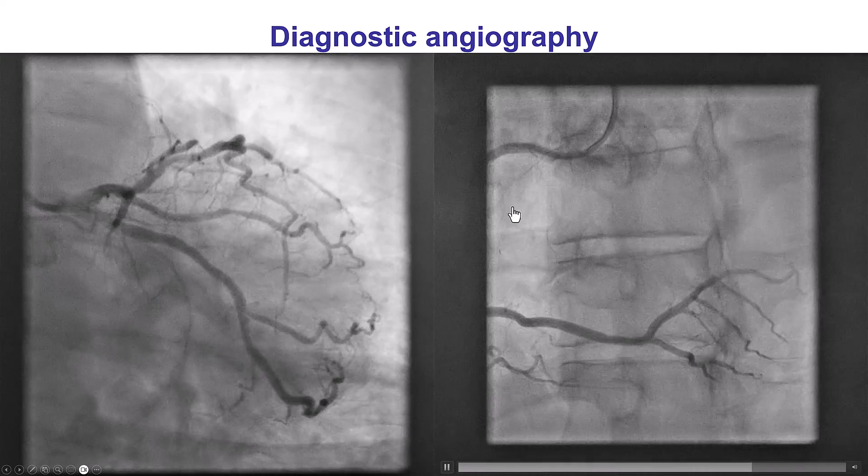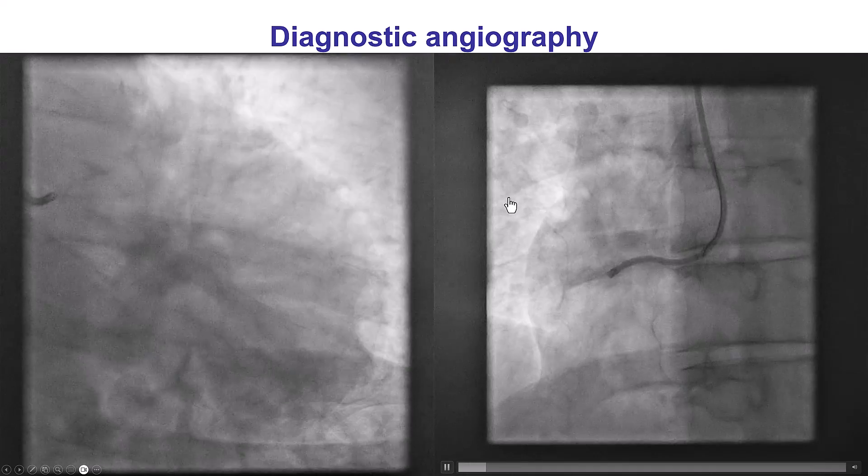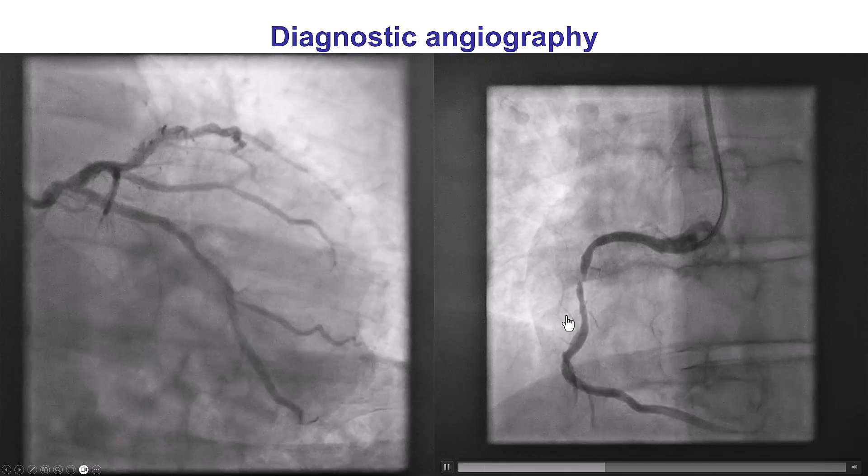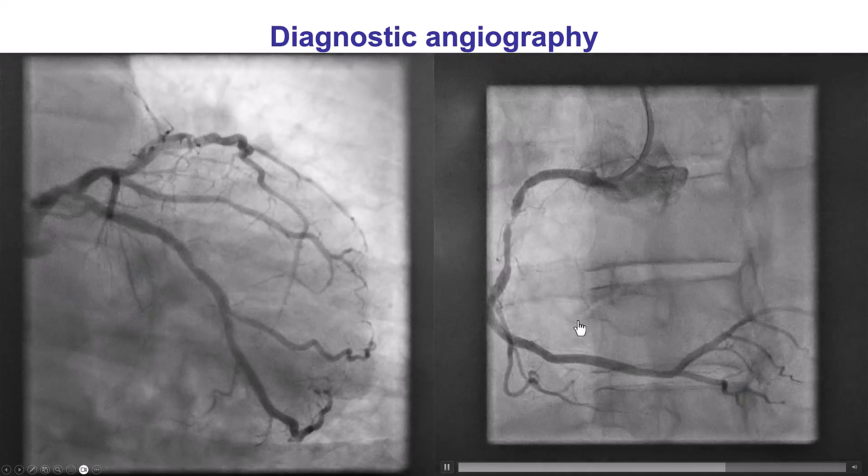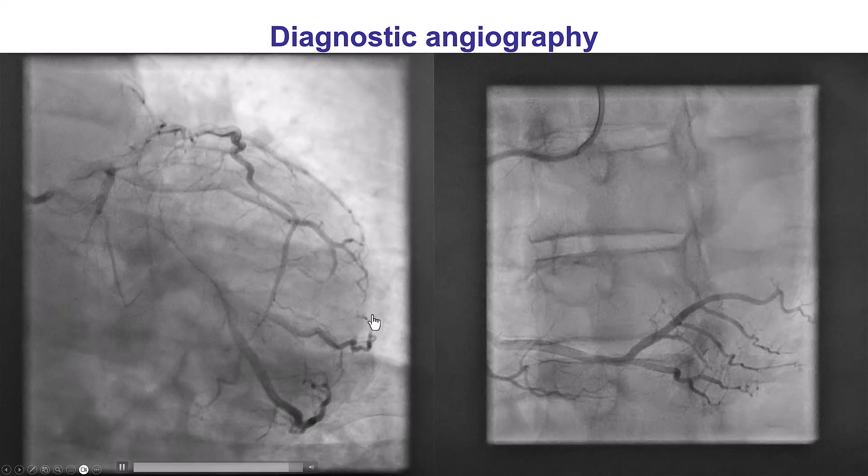This is the coronary angiogram, which confirmed the findings. There is a severe lesion in the right coronary artery.